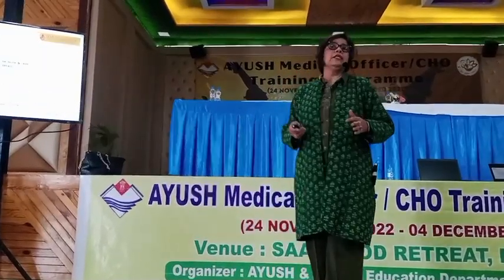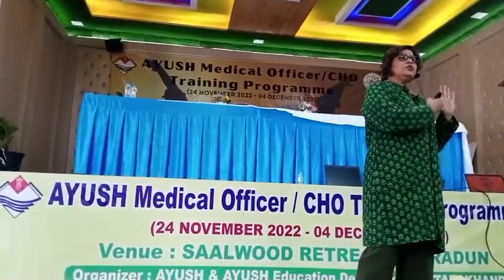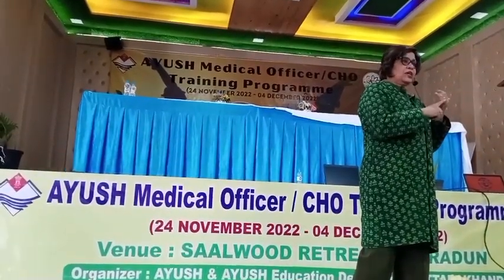Coming to the first thing that we do when we take a sample. चाहे आप urine sample लो, blood sample लो, tissue sample लो, सबसे पहले हमको क्या चाहिए? Identification of the patient. आपका सैंपल कहीं और ले रहा है और ट्रैवल करता है किसी बॉक्स में और कहीं और जाता है, पर उसकी एक आइडेंटिटी कैसे होती है? We have to be sure that my sample has my name. And now there can be two Dr. Neelams, there can be two Neelams. What is the thing? Then I look for an age.